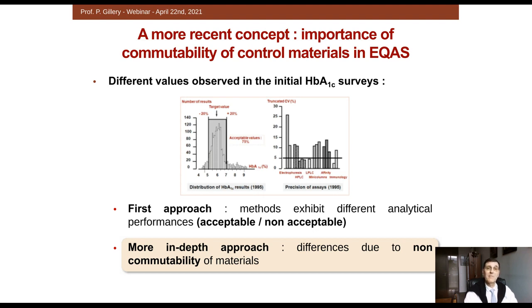Why? Because a more recent concept has appeared, which is the importance of commutability of control materials in external quality assessment schemes.